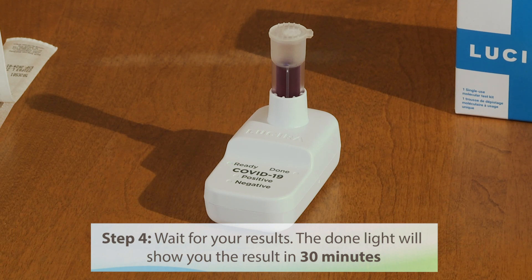Step 4: Wait for your results. The Dunlite will tell you when the test is ready in 30 minutes.